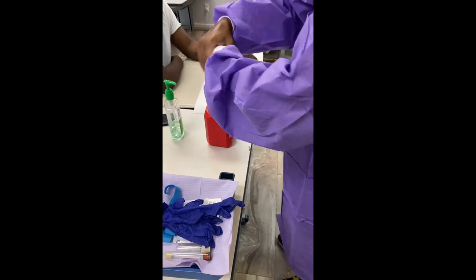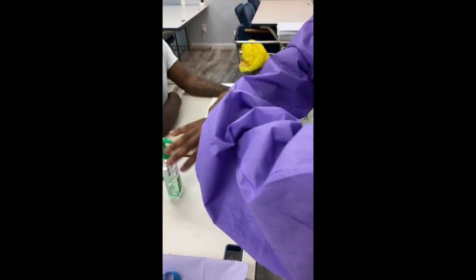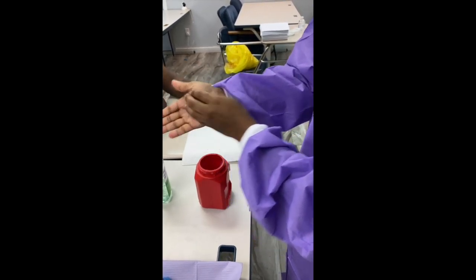Now I'm going to sanitize. I put about a dime size of sanitizer on my hands, and depending on the size of your hands, you might need a quarter size. I'm going to rub vigorously and get all surfaces of my hands, in between my fingers, my wrists, and rub it in until it's all dry — and always get your nails.